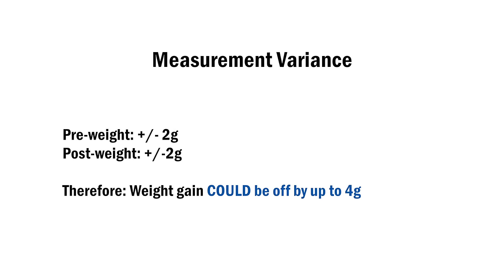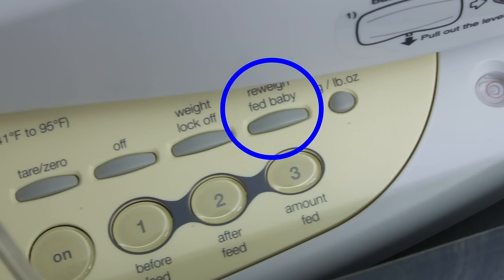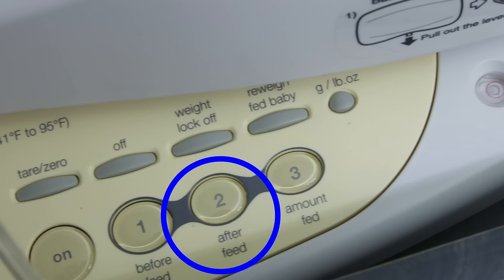These scales have been proven to be accurate plus or minus 2 milliliters, which means it could be up to 4 milliliters different than the actual intake. Note: if you want to weigh the baby partway through the feed and then again at the end, you can use the 're-weigh fed baby' button as many times as you want. Just ensure to press 2 after each time and it will continue to calculate the total in relation to the original pre-weight when you press 3.